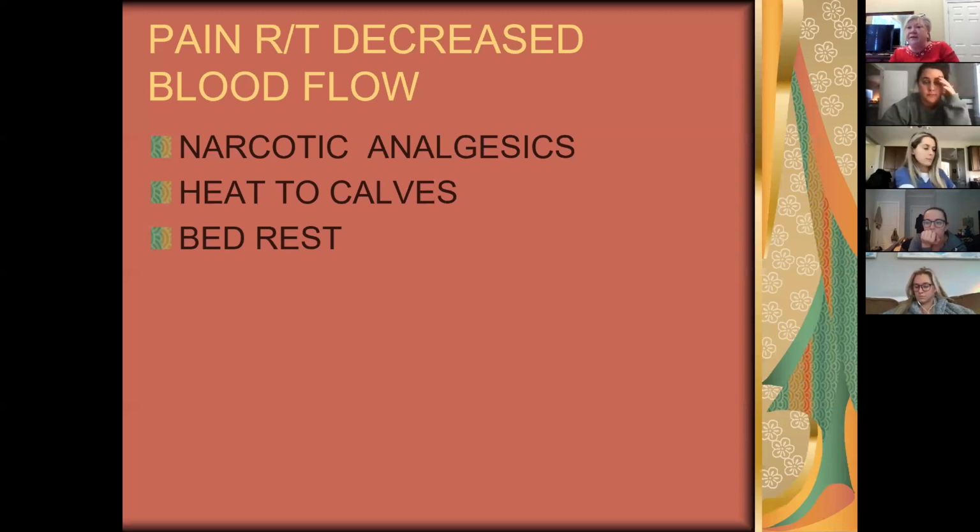But usually, on the end of a hyperalimentation or going through a central line, they're there as bubble catchers. Yes, that's not an IVC filter. That's just a different filter, like a filter for blood. That's for catching clots when you're giving a blood transfusion. So that's different than an IVC filter.